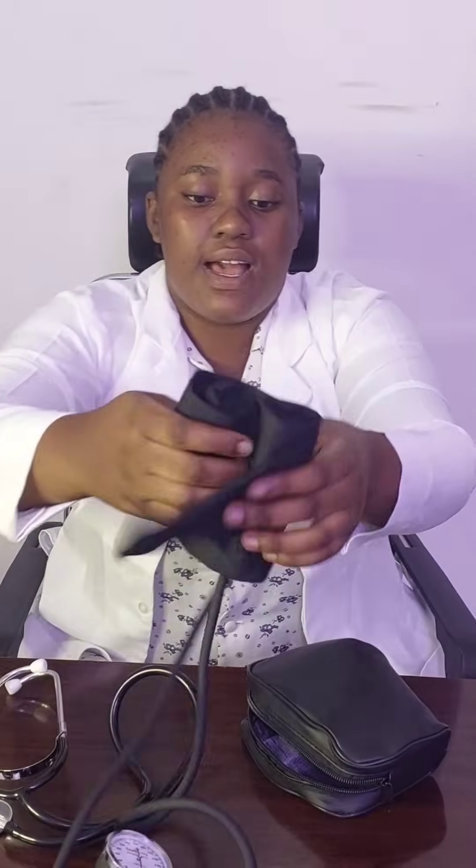After checking the blood pressure, you fold the sphygmomanometer back into the bag to avoid rust or damage, and place the stethoscope back into the bag. The normal range for blood pressure is 90 to 120 for systolic and 60 to 80 for diastolic.